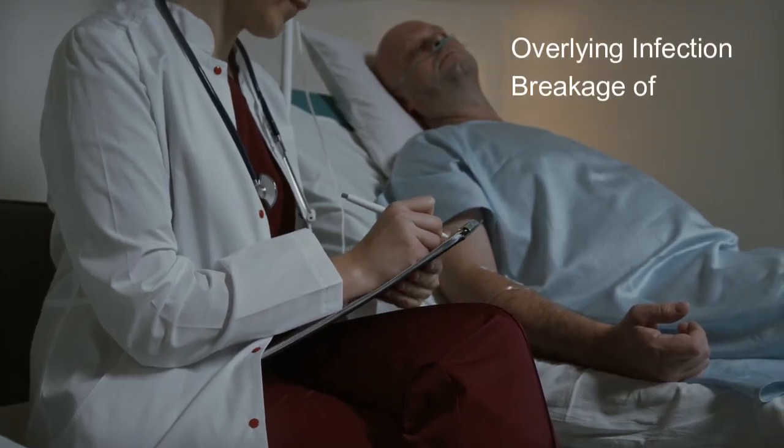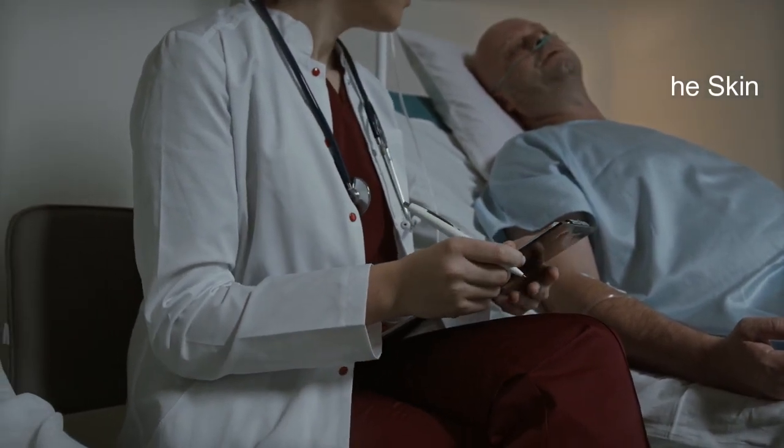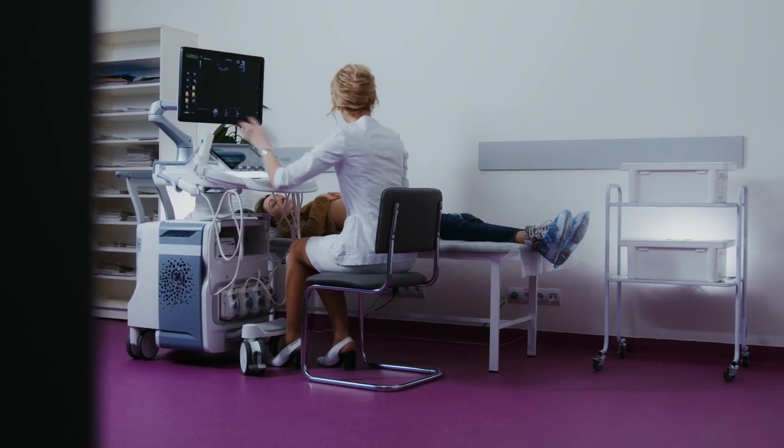Now, I'm going to go ahead and show you how we do that point of care renal ultrasound, but I'll discuss some contraindications now. There are no definite contraindications when it comes to performing renal ultrasound. You might want to be careful if a patient has overlying signs of infection or breakage in the skin. But really, the biggest thing to be concerned with is if you're ever unsure about your findings, if findings don't look perfectly normal, then you might want to consider a formal ultrasound study to be able to determine the cause of any potential pathology that you might be seeing.